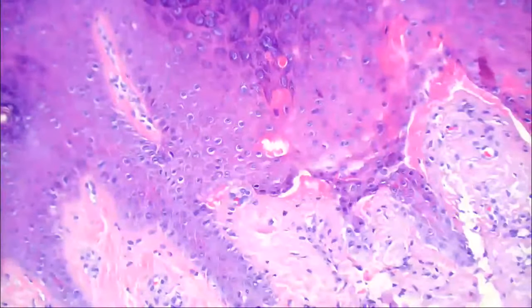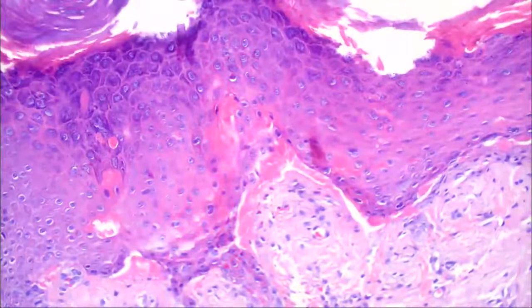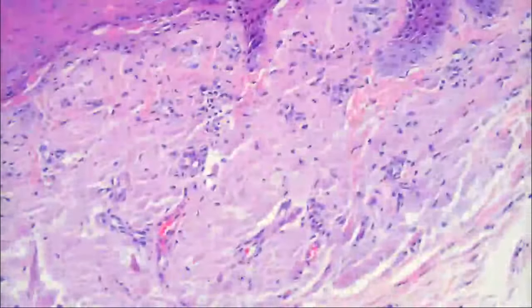So this starts off, we don't know exactly what happens. Probably something happens where they get small, tiny collections of amyloid, and macular amyloid is very itchy. They scratch, and then they get this marked lichen simplex chronicus with more dyskeratotic keratinocytes, and it turns into lichen amyloidosis. So this is lichen amyloid, which is basically the same spectrum as macular amyloid.